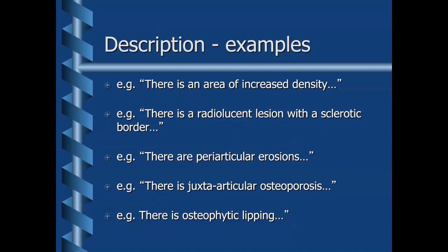If you think of it in terms of medico-legal, if your report ended up in a court of law, a lawyer would have an absolute field day with you if you hadn't used this appropriate terminology. So it's highly important to protect yourself from a selfish perspective, but also to do the best for the patient, so everyone knows exactly what you've found on the x-rays.